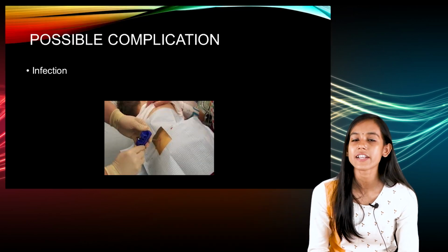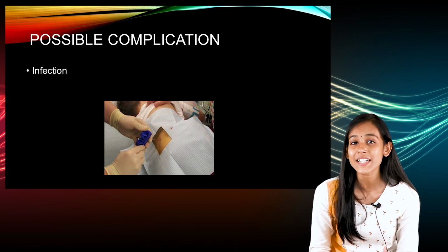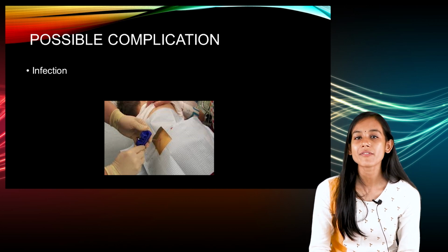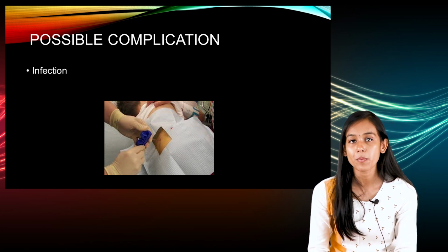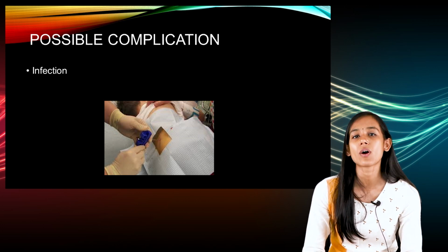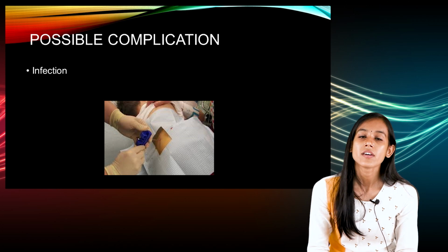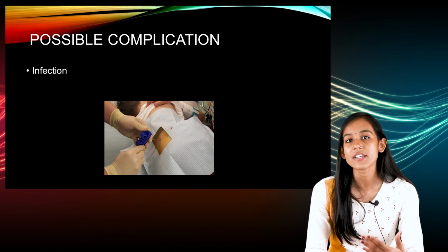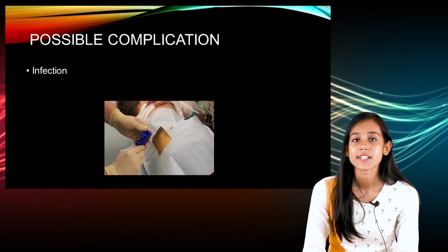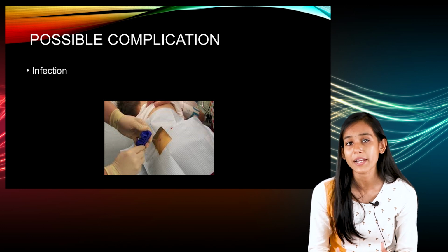The first complication is infection. If the needles or equipment that we are using are not correctly cleaned, or the aseptic technique is not followed, it might carry infection and transfer it to the bone marrow. So in that way, definitely there is a high chance of infection.